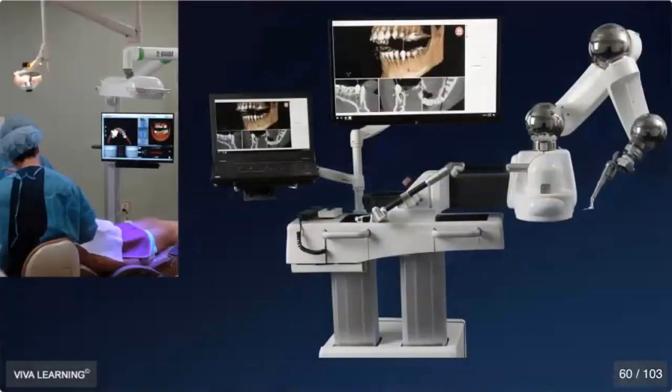And I'm at the point now where for every case I do, I'm considering a guided option. We have a lot of options right now. It's a really great time to be in implant dentistry. These examples are for dynamic guided navigation systems. So these augmented reality systems where you're using your hand to drill, especially on the top left with the X guide. You're using your hand to drill, but you're watching the screen, and the screen is giving you feedback about your implant position, your drill position as you're going in terms of angulation and depth. The one on the right, that's a new one, very expensive, robotically assisted.